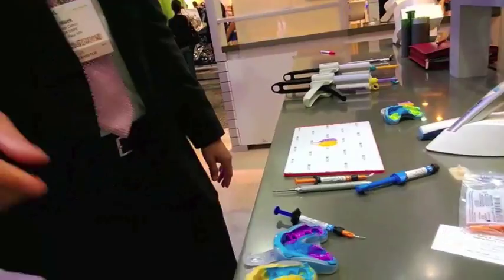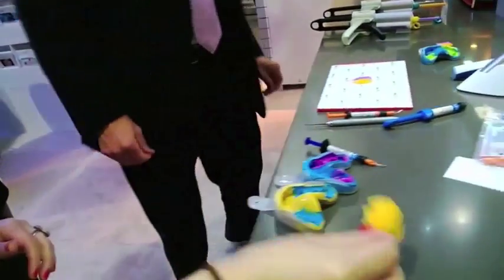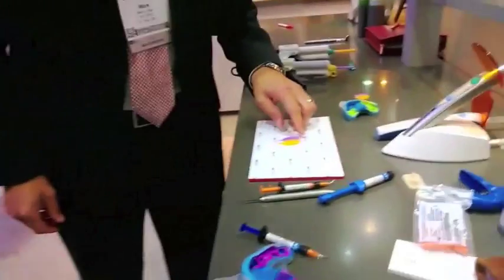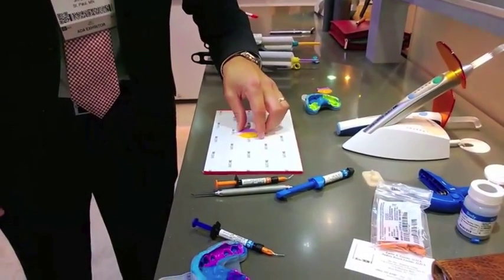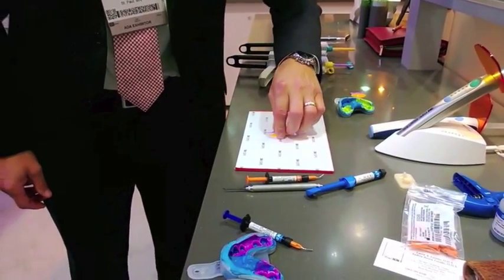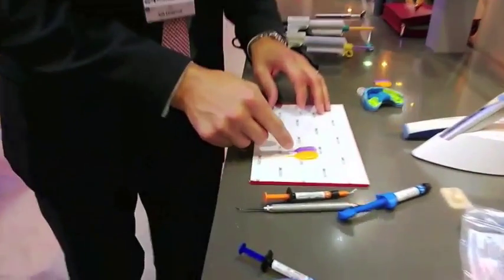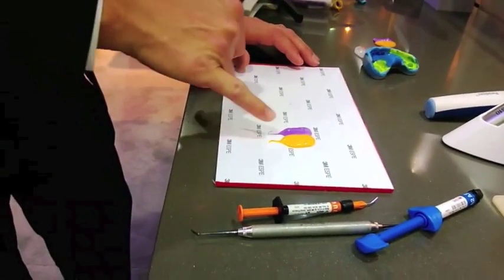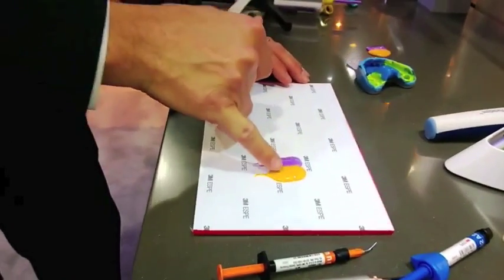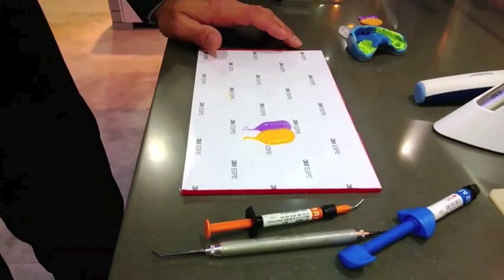You can see all the fine details — all the little ridges and wrinkles. In our impression material, there's no crater, so to speak, in the material, which ultimately could lead to voids in the impression.